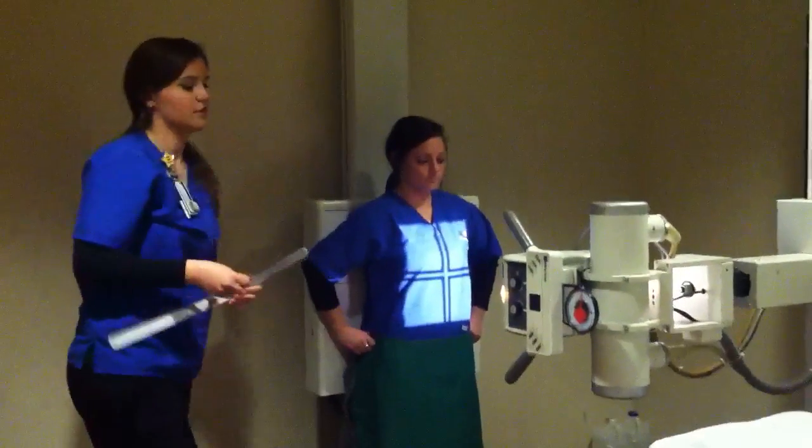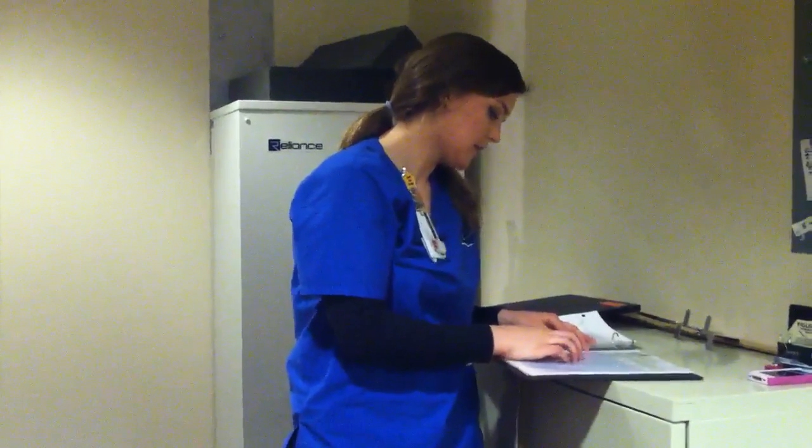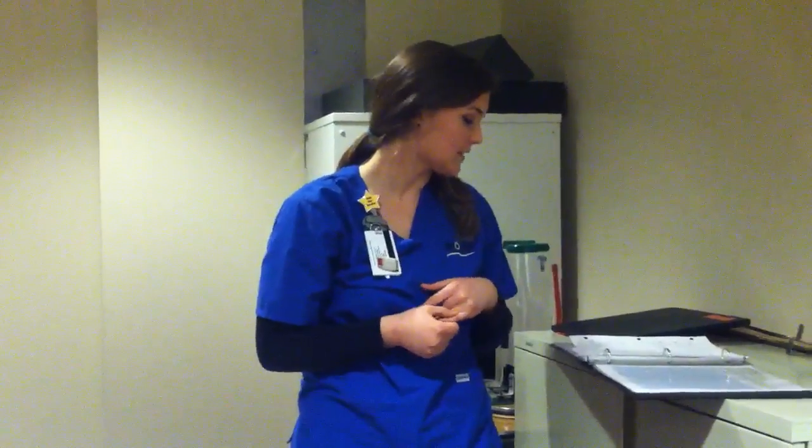About 22 centimeters. So again, she has barium in her, so 22 centimeters is going to be 101 kVp, 10 mAs in a large focal spot, and again, I'll have her double breathe and take the exposure on suspended expiration. You'll continue taking pictures like this at that predetermined interval and until the barium reaches the cecum, and this will demonstrate characteristic pathology that would help in the diagnosis of Crohn's disease.